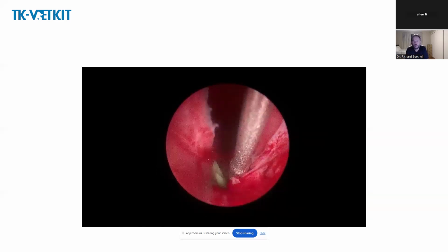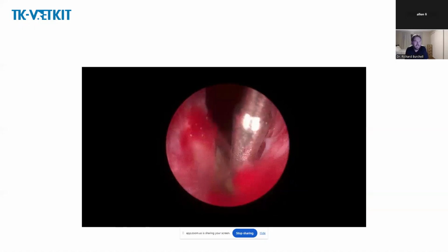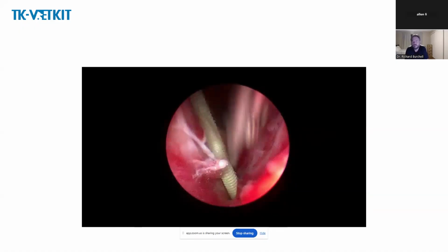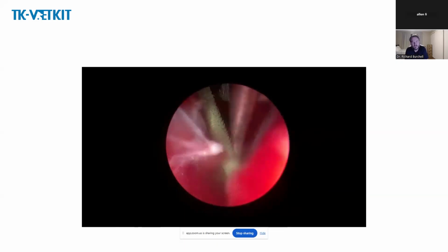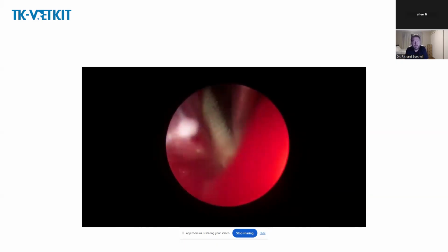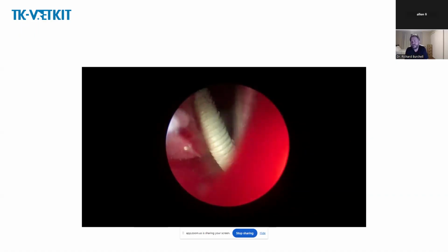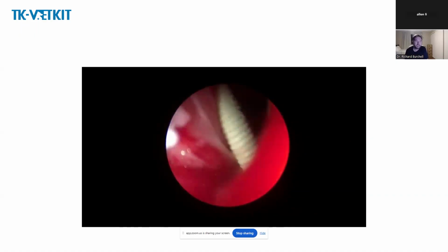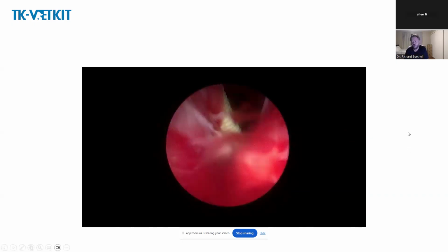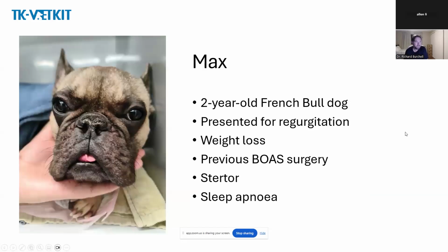So this is something that if you have a rigid endoscope, all you need to do is buy the scissors. I think these scissors cost me about $600. I bought them some time back. But there'll be a number of suppliers you can potentially get these little scissors from, and you basically feed these down the scope, and you can correct ectopic ureters, and you don't need anything fancy beyond having a scope.